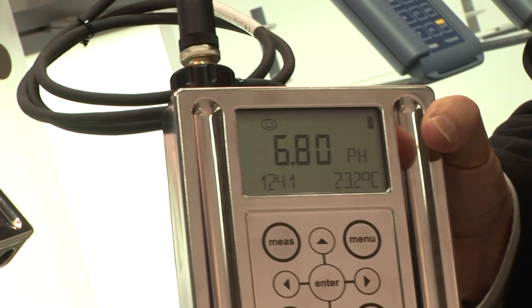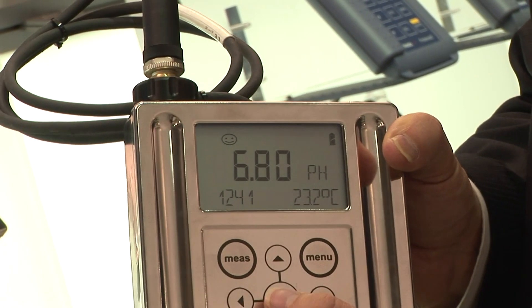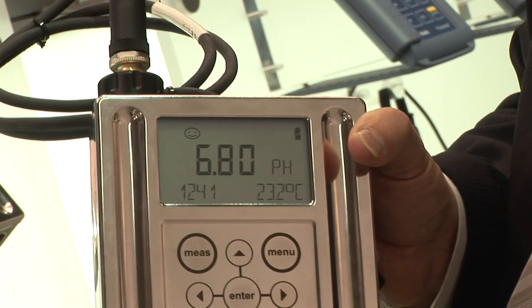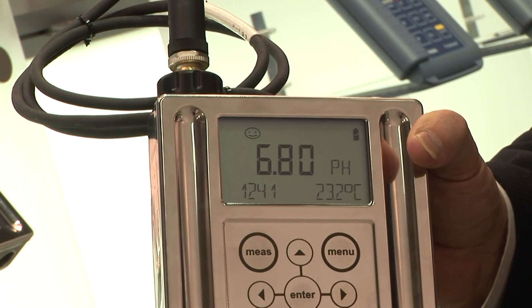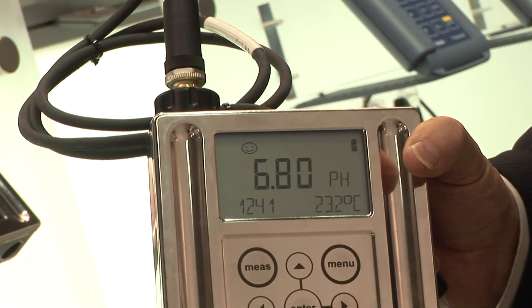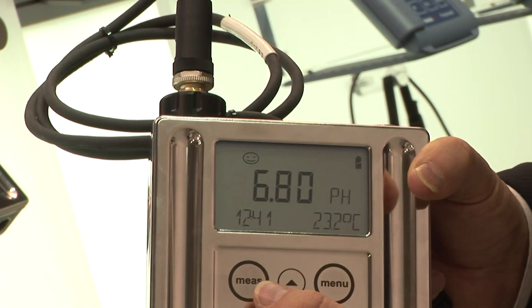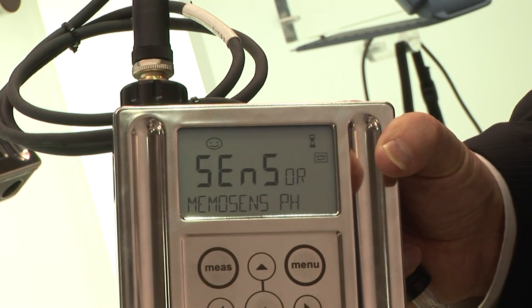In the display with the digital module, we can display all the sensor data, which will also show the operating time and the maximum temperatures the sensor has seen so far. You can also view the last calibration values inside the system by going into the menu and looking at the sensor information.